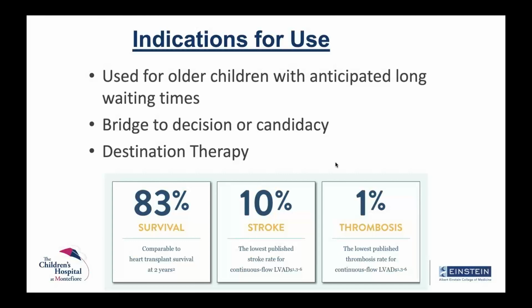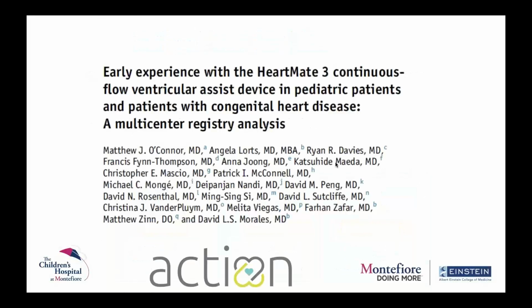So in adults, the numbers down here are amazing from an adult standpoint. They have 83% survival on this device. There is only a 10% stroke rate, and there is only a 1% thrombosis risk, which is the lowest the adults have seen in a long time. And this device is, that's why, one of the latest and the greatest in the field.